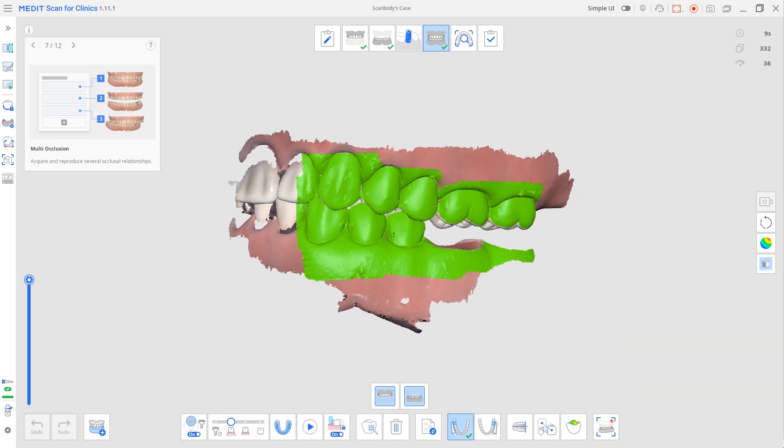Now, place the scan body in and scan from the adjacent teeth.